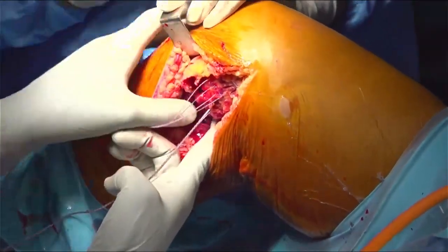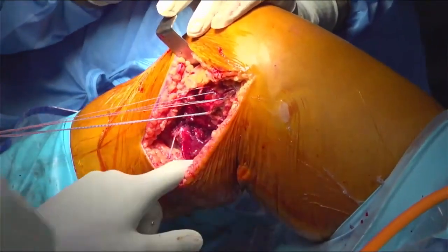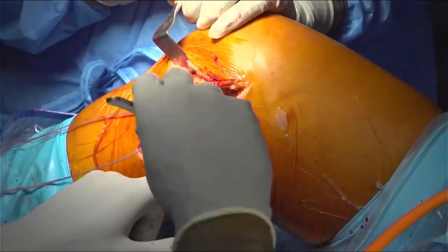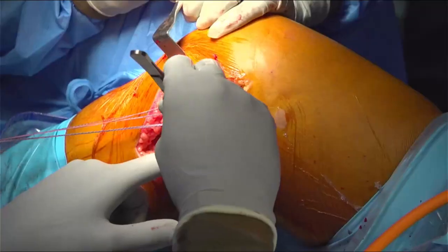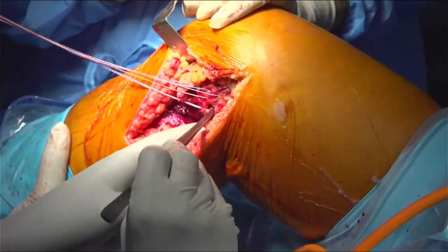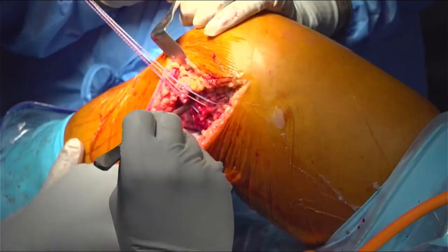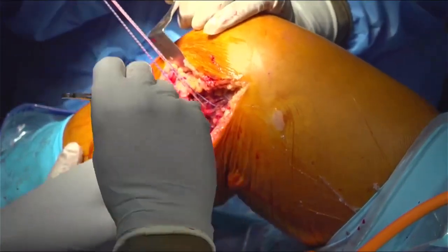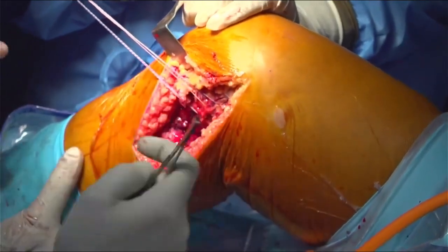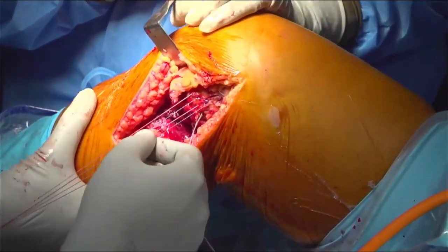We will have to pull a little bit forward. Relax. So now, non-tooth forceps please. Non-tooth forceps please. Give a little more anterior slide. So that is okay. Relax. This will close later on. This will be closing. Give it a little more anterior. So now we will be closing the meniscotibial ligaments in this fashion.